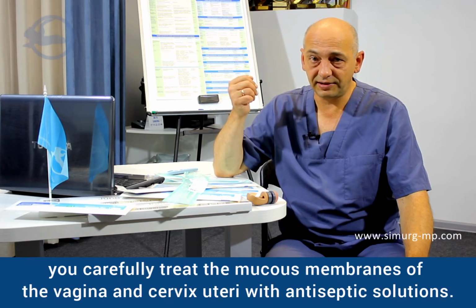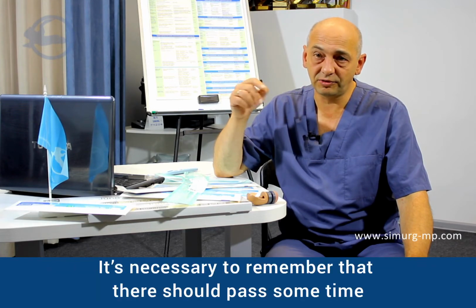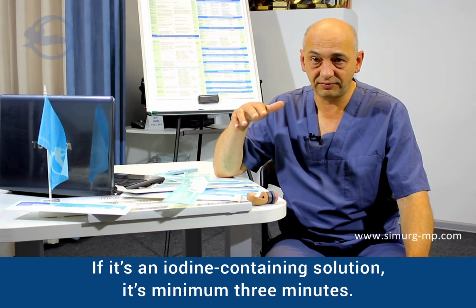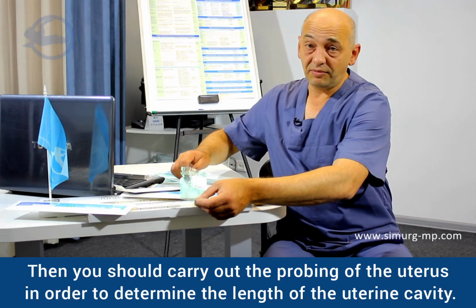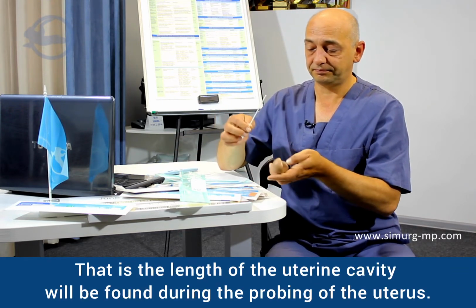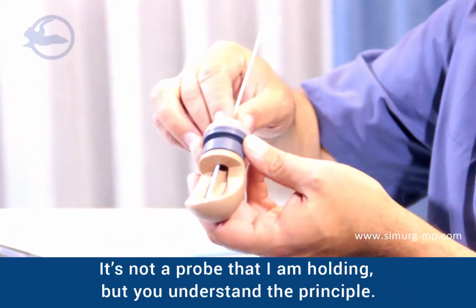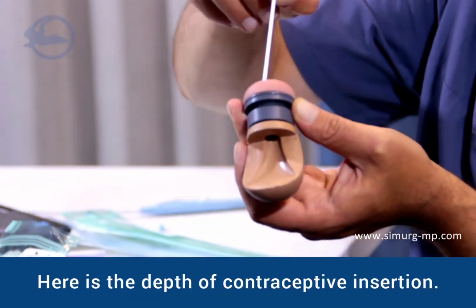You carefully treat the mucous membranes of the vagina and cervix with antiseptic solutions. It's necessary to remember that there should pass some time from the moment of treatment of the mucous membranes with antiseptic before its antiseptic effect will start. If it's an iodine-containing solution, it's minimum 3 minutes. Then you should carry out the probing of the uterus in order to determine the length of the uterine cavity. That is, the length of the uterine cavity will be found during the probing of the uterus. It's not really a probe that I'm holding, but you can understand the principle. Here is the depth of contraceptive insertion.